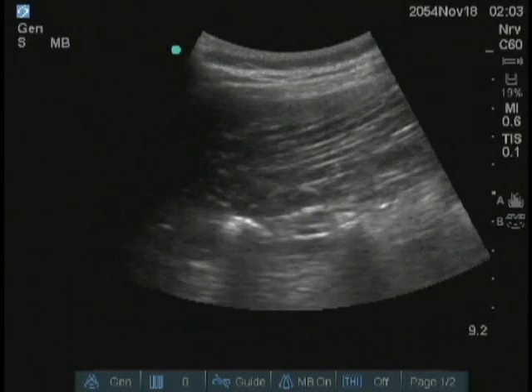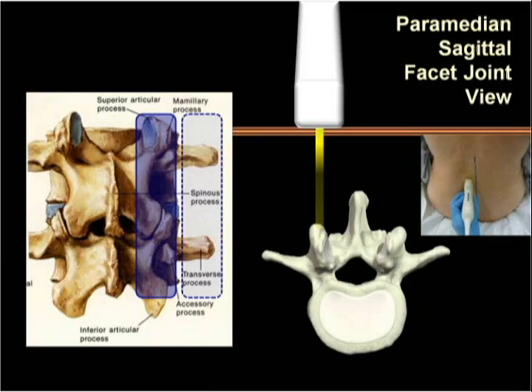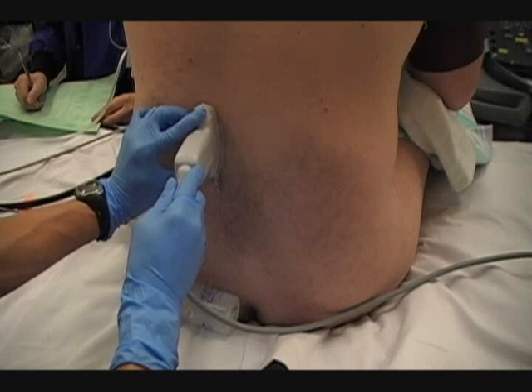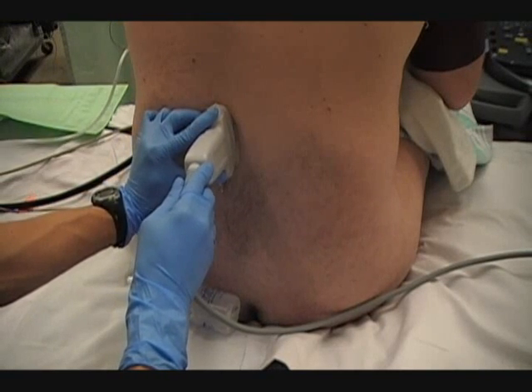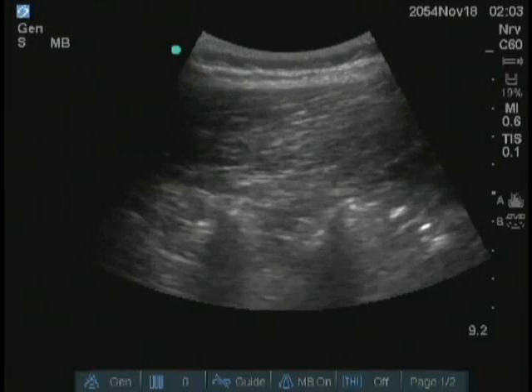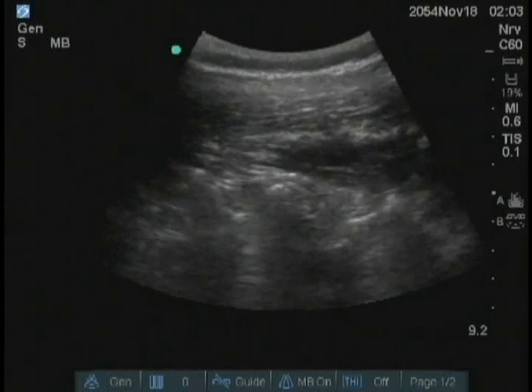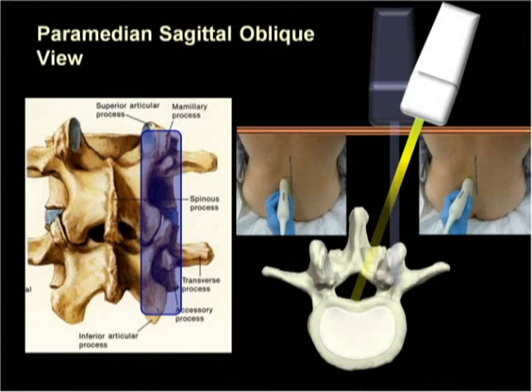From this view, slide the probe medially to lie over the articular processes maintaining a sagittal orientation. The ultrasonographic view changes to show a continuous hyperechoic line of humps, which represent the facet joints between overlapping articular processes. At this point, the probe should not be slid any further, but instead tilted to angle the ultrasound beam towards the midline. This directs the beam onto the lamina and the paramedian interlaminar spaces to obtain the paramedian sagittal oblique view.